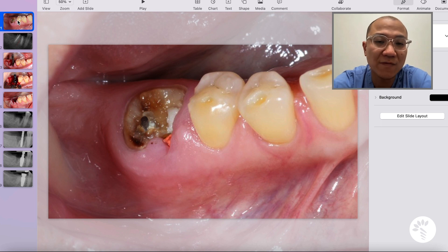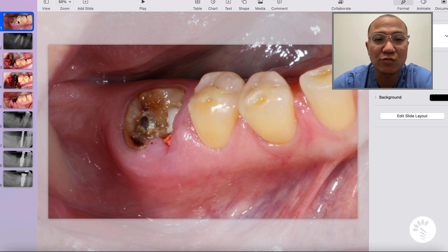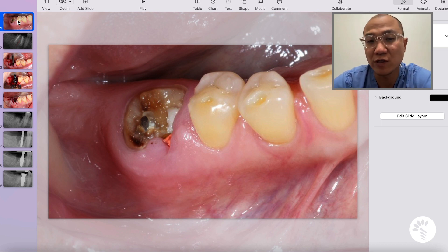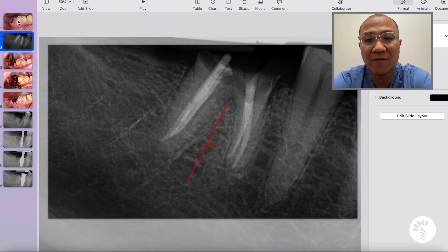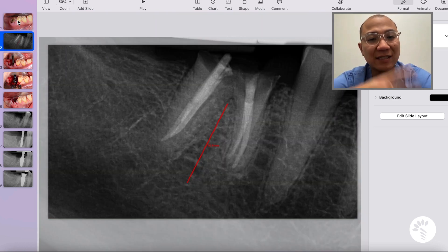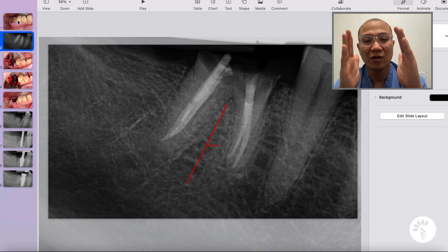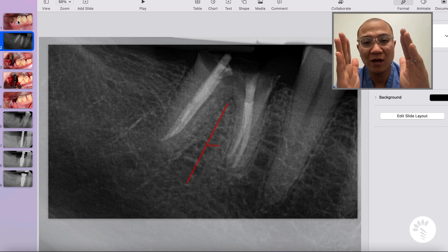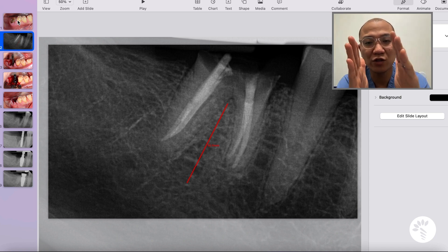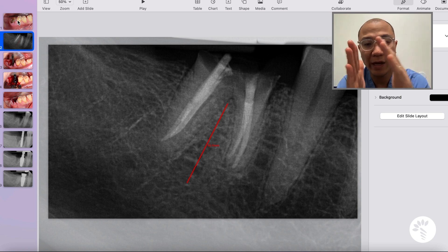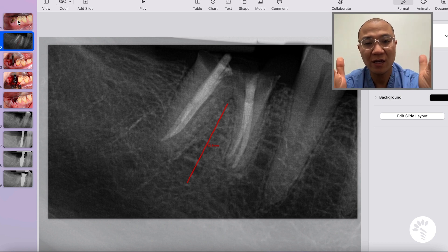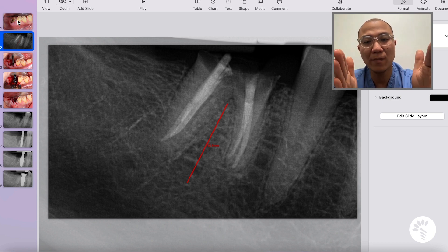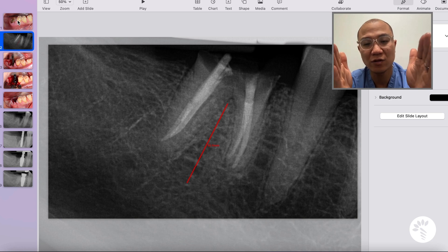As you can see, the tooth was fractured at the gingival line and it was deemed unrestorable. This is the radiographic view before the extraction. As you can see in this case, the mesial and distal roots appear to be relatively well diverging, leaving a lot of septal bone that is available to secure the implant.